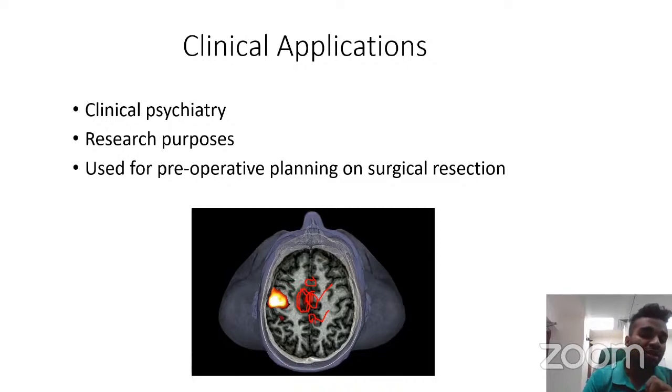So after doing fMRI, by giving the patient the task of tapping of fingers or foot, or movement of foot, we will get to know where exactly in that specific patient the activation is happening, in the sense when that patient moves his foot, where exactly the activation is happening, so that by finishing fMRI, the doctor would have an idea exactly which is the region controlling it, and whether it is in close proximity to the lesion, or away from the lesion.